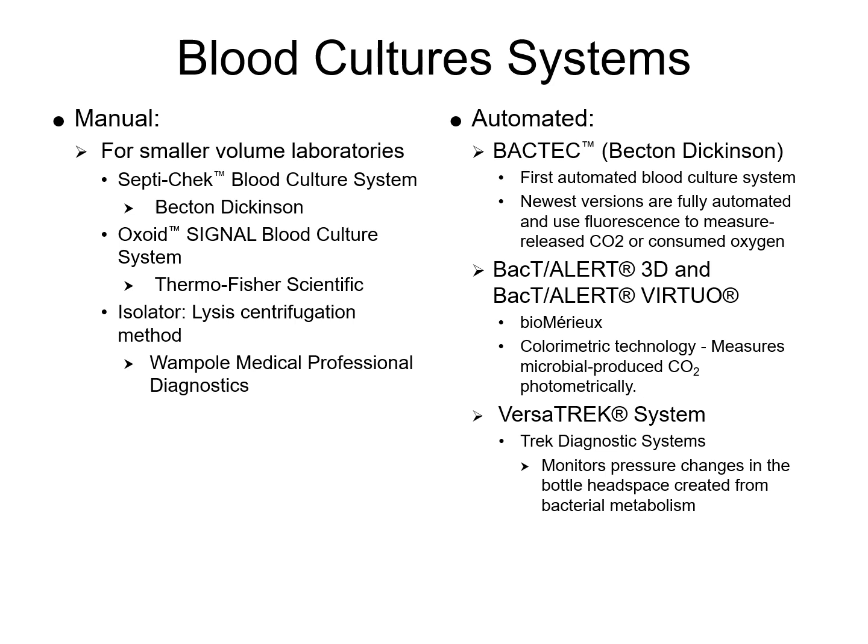Your automated systems, basically what they're doing, like with your BACTEC, is looking for usually either some sort of radioactive type of change, where something is radioactively labeled and you're looking for the release of CO2 with that radioactive label, or CO2 is being measured via some sort of infrared spectrophotometry, or even with your newer versions of these analyzers, it's looking for a fluorescence type of reaction, looking for the release of that CO2 or any of the oxygen that's been consumed within that bottle.